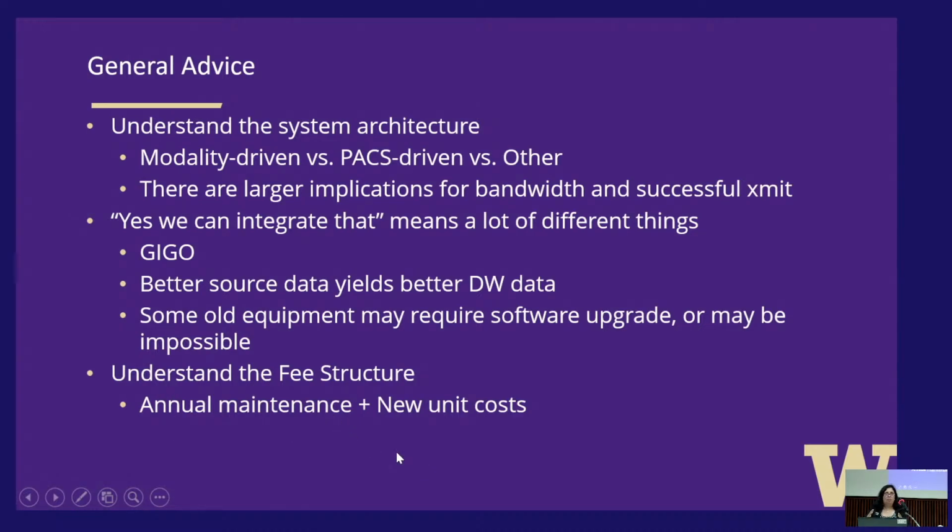And then it gets complicated when you have more than one hospital system like we do, right? We have 5 different sites that we are connecting, and it becomes a real management issue with Dosewatch. For us, we had one person in our group, a faculty member, who was covered 30% FTE just to manage Dosewatch, because it is a lot of work.